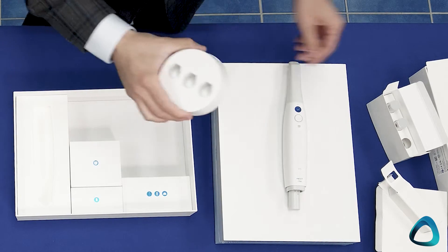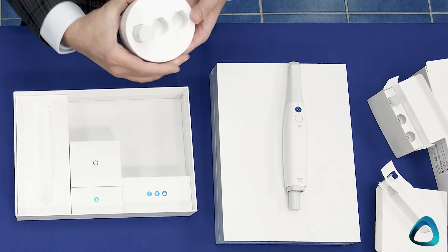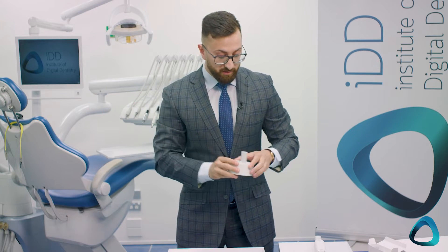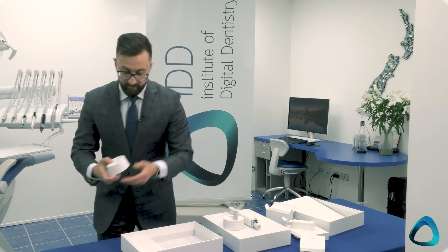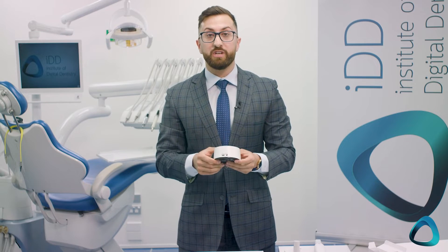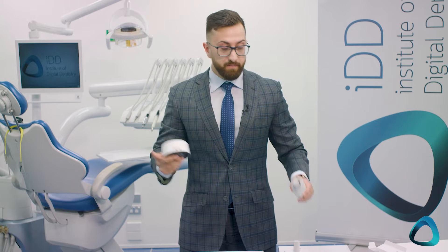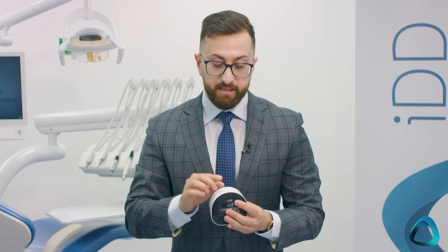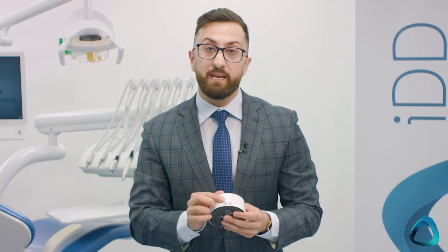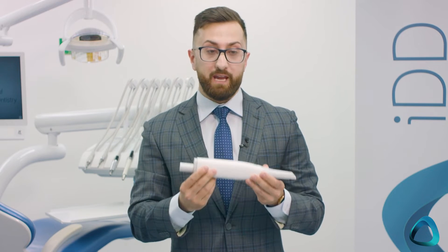This is the charging station — it fits three batteries simultaneously. Next, we have the connection hub. Although the scanner is wireless, you still need some form of connection to your computer and your Medit Link software. This hub connects via USB-C to your computer and sits on your desk or cart, enabling the scanner to communicate wirelessly.